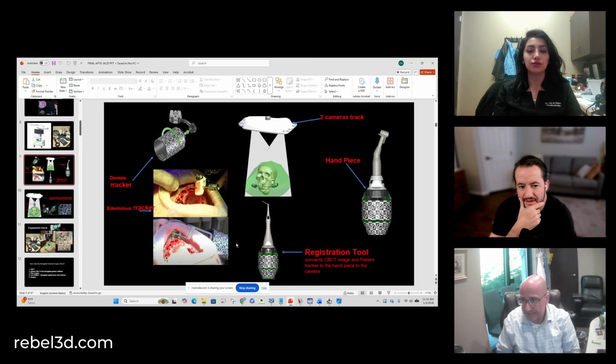So you can angulate your multi-unit with the new implant position that you had just planned. You can adjust the position of the implant, the angulation, the orientation, all those things. So definitely it allows you better accuracy. You don't have to worry about the flexure of the guides or anything breaking on you or debonding.